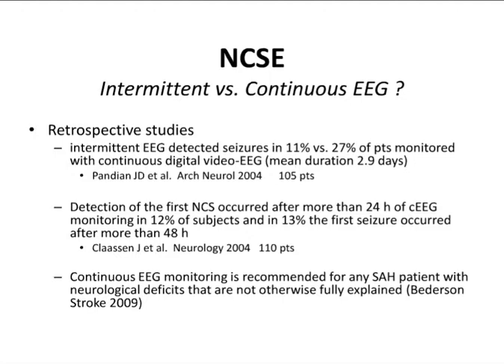So the fact of having a continuous EEG, and if you add the video, is important in the ICU setting, because there may be quite a lot of artifacts in these particular settings. So it's important to differentiate between an artifact and a seizure. And probably the most difficult thing when you interpret EEG and you use continuous EEG monitoring is actually differentiating between the seizure and an artifact.